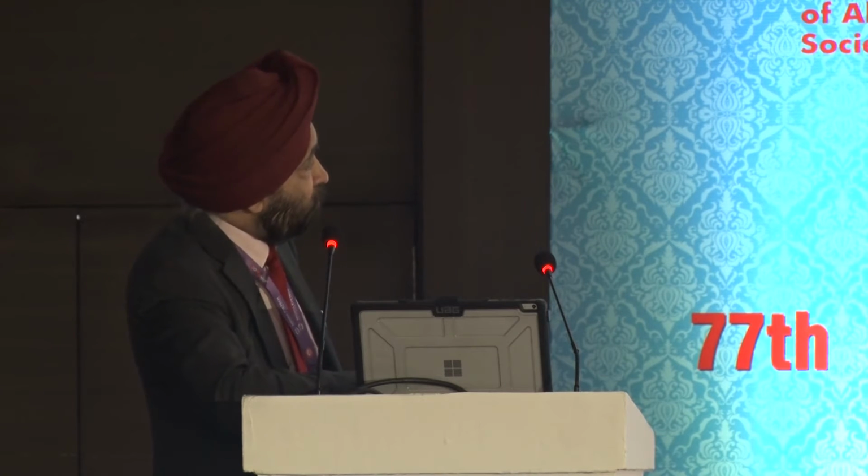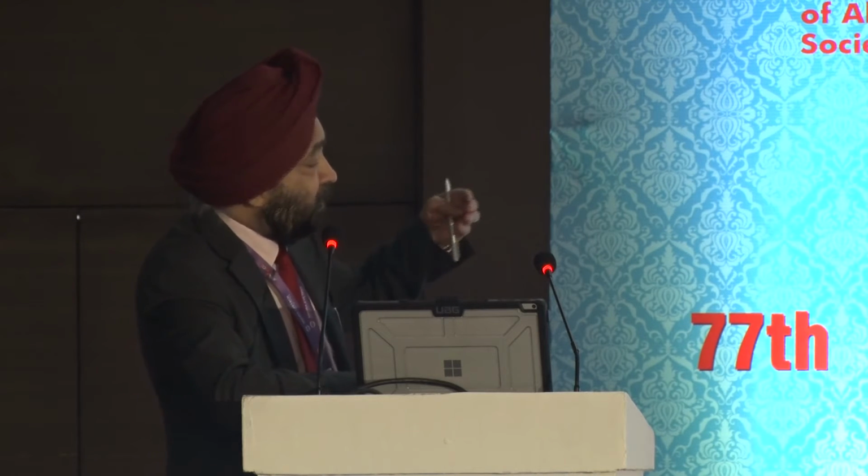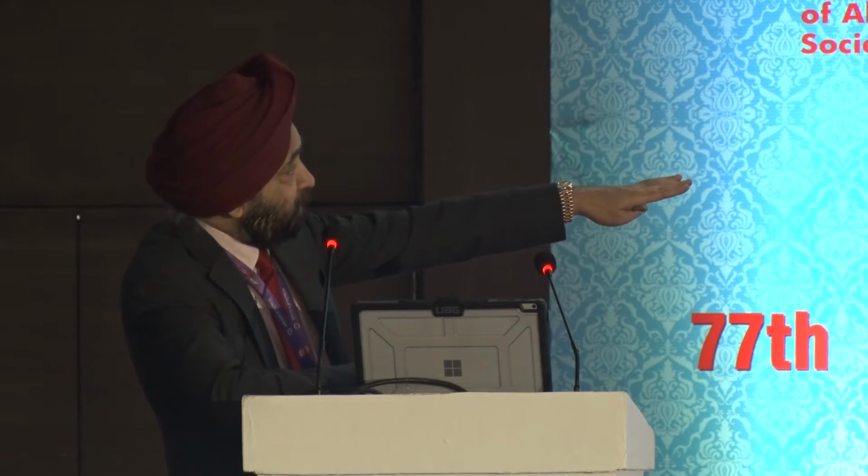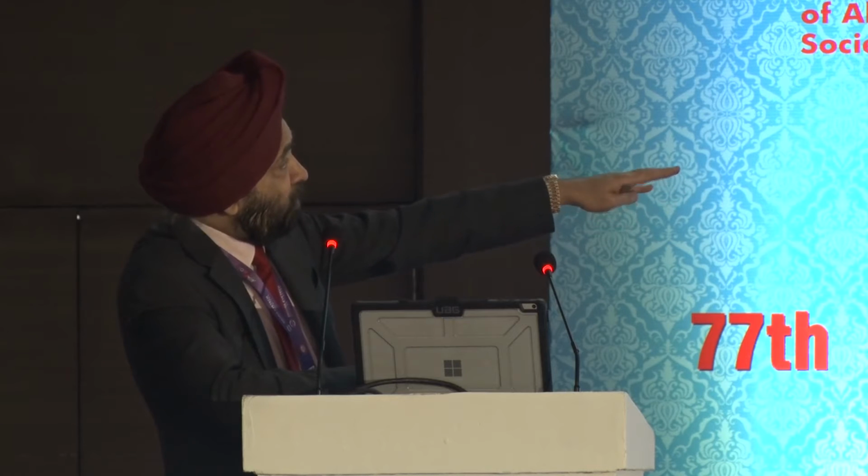This is trypan blue that we are going to put. And I'll just show you the images that we will get. So this is the chandelier illumination. The microscope is off. And we are getting the light bypassing the corneal opacity. So the light goes directly, hits the retina, and then comes back, and look at the view. It gives you a fantastic 3D. Can you look at the depth perception that you are getting? It's a fantastic depth perception, and you cannot believe that there is a corneal opacity that is there.